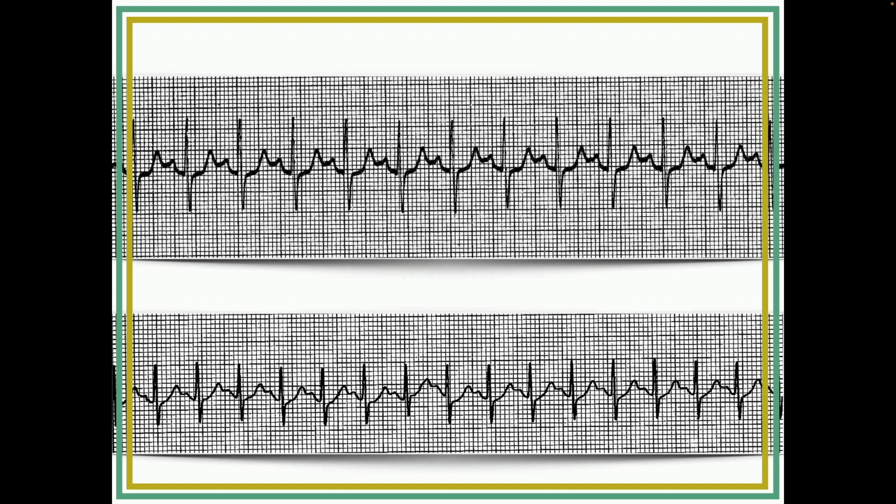Exactly as you see on this strip here, you can see the P wave has started to move a little bit closer to the T wave, and the back end of the T wave gets deformed, and the front end of the P wave gets deformed as they move together. And then here it's even more pronounced, where the P wave in this case is really just a little bump off the back of the T wave. And you don't have to do this at all.